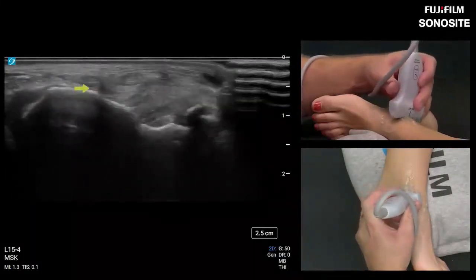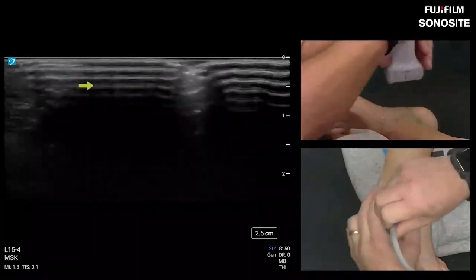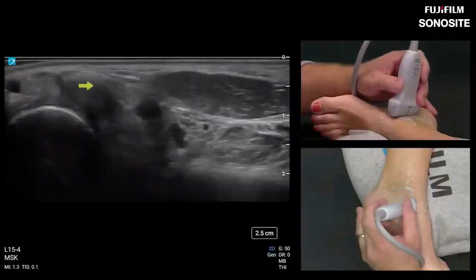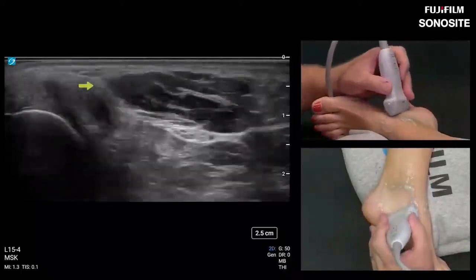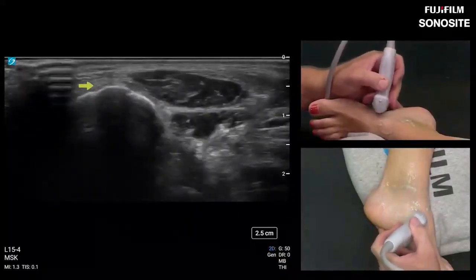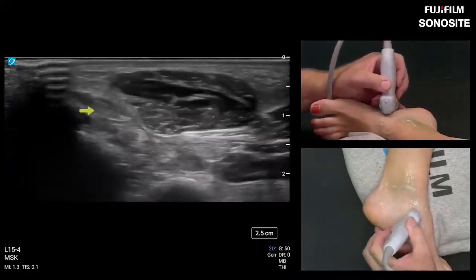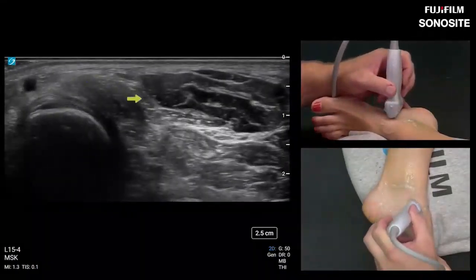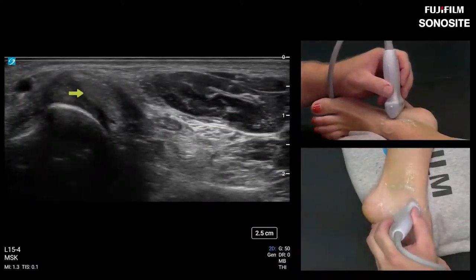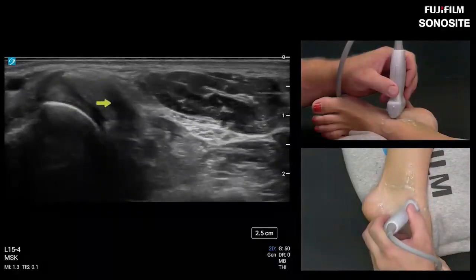And then its neighbor was the flexor digitorum longus. I apologize, I did flip the probe, bad habit. So we'll go back down just to check our work again. We already did the hard part, right? And that was the ligaments underneath it. So here's the navicular, and then we can see the tibialis posterior here. And you see two ovals here. One of those is spring ligament, which is over here. And then here was that tibialis posterior.